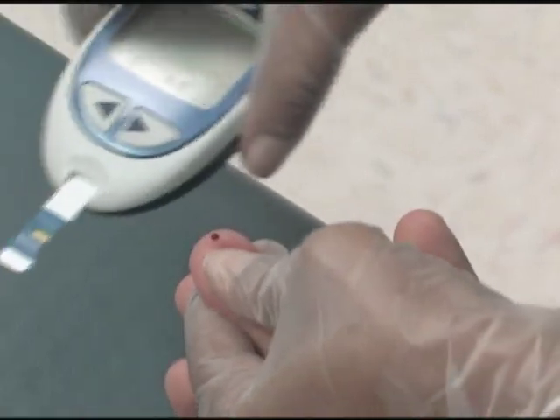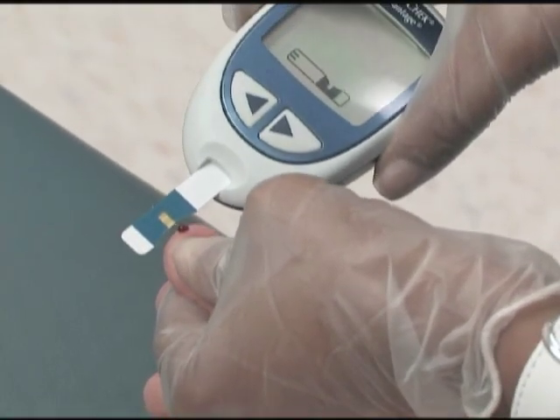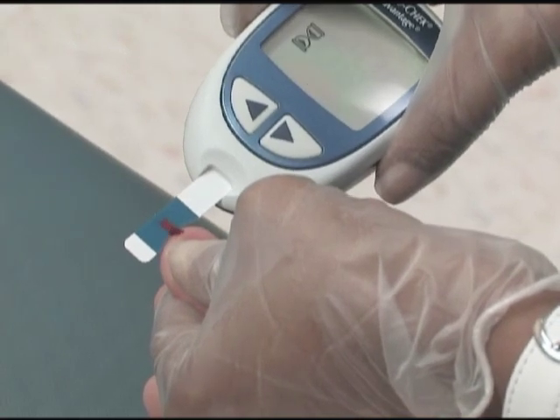Blood glucose is measured with simple meters, either in the home or in the medical office. The AccuCheck is one such meter.